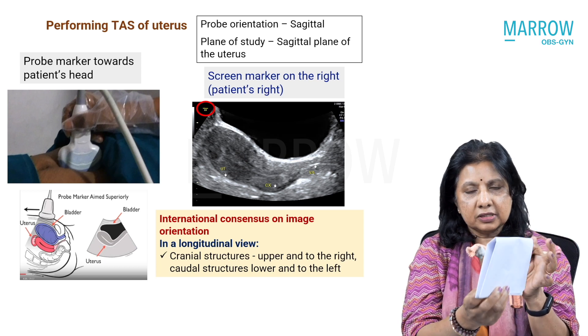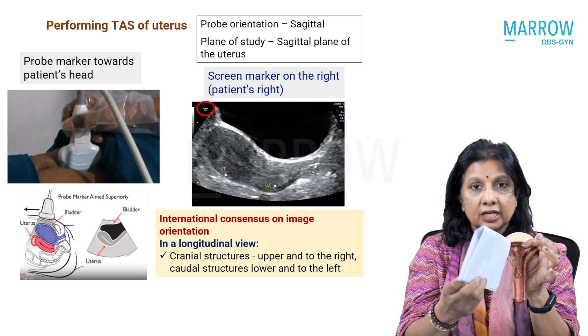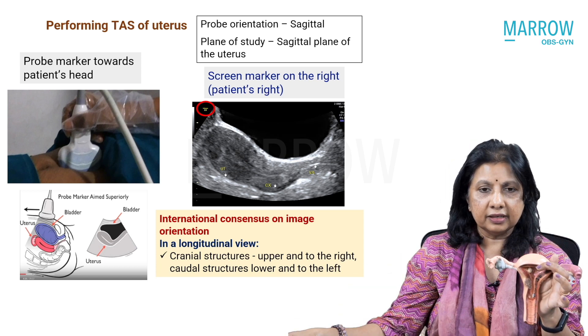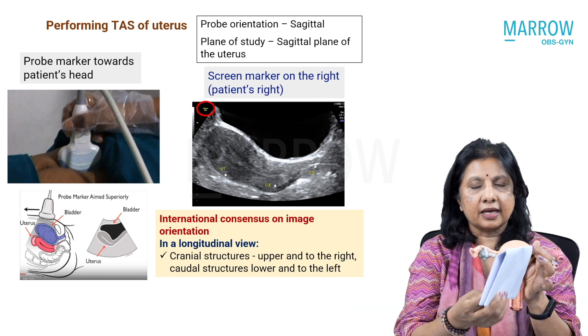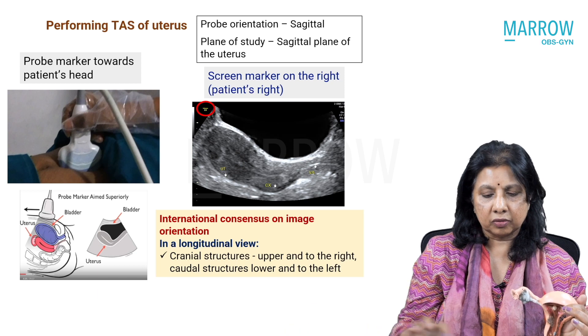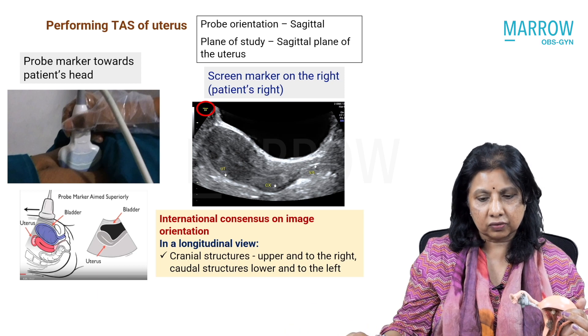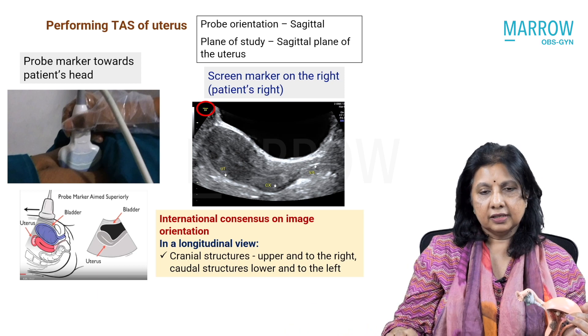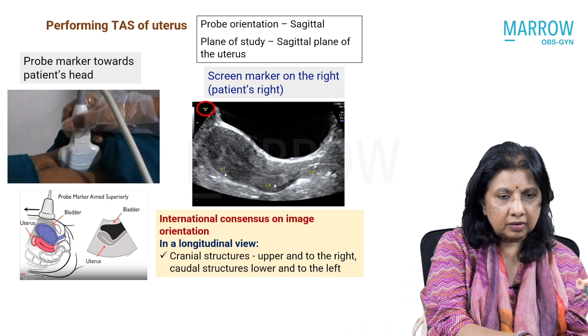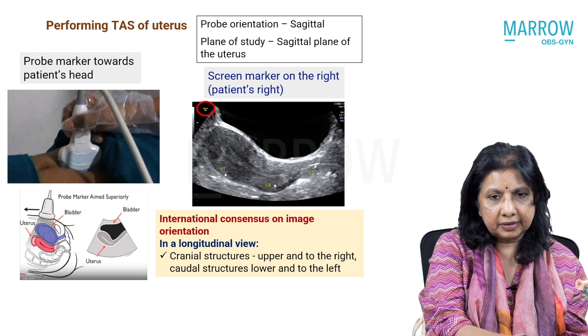So because it takes sagittal planes only, we see this anterior and posterior orientation of the uterus. So let's see the same thing on a clip.